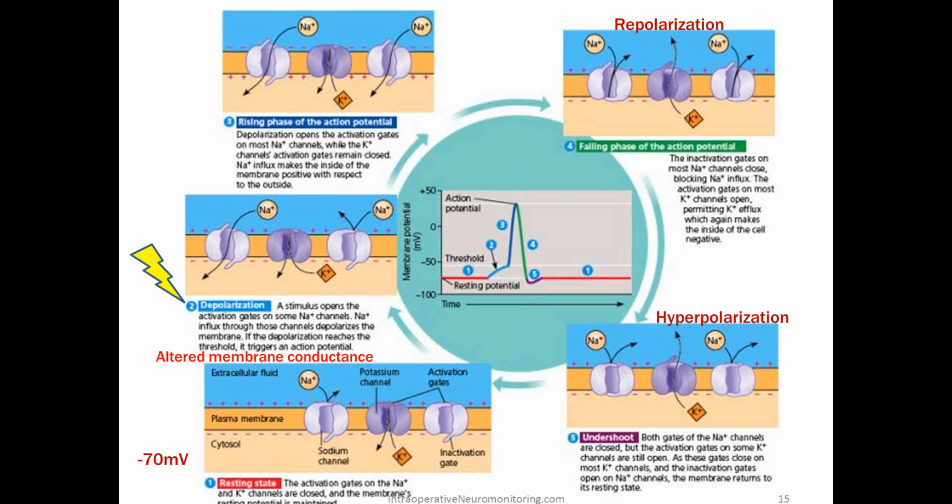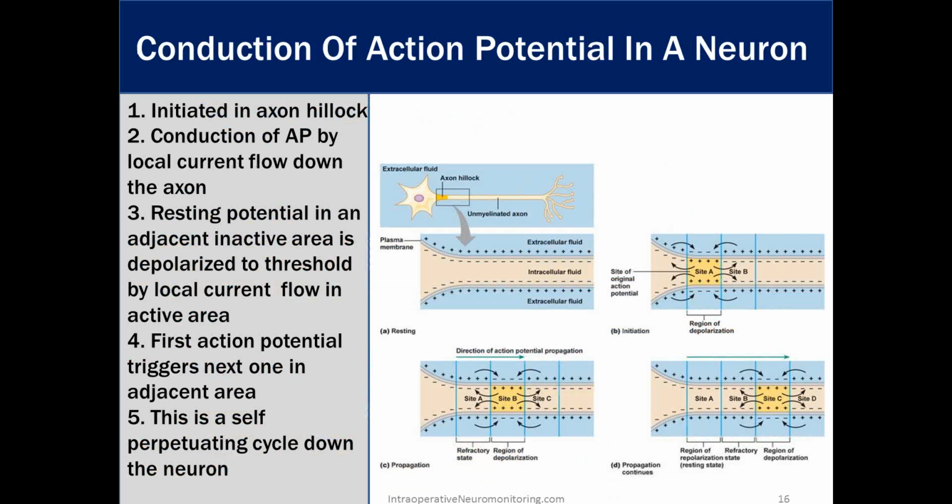So this is kind of background information, and we will get to where it is clinically useful when we start looking at things like motor evoked potentials, or even other things like the blink reflex or bulbocavernosus reflex, or even SSEPs. And if you've read some of my stuff on the blog, you might already know where I'm going with some of that.